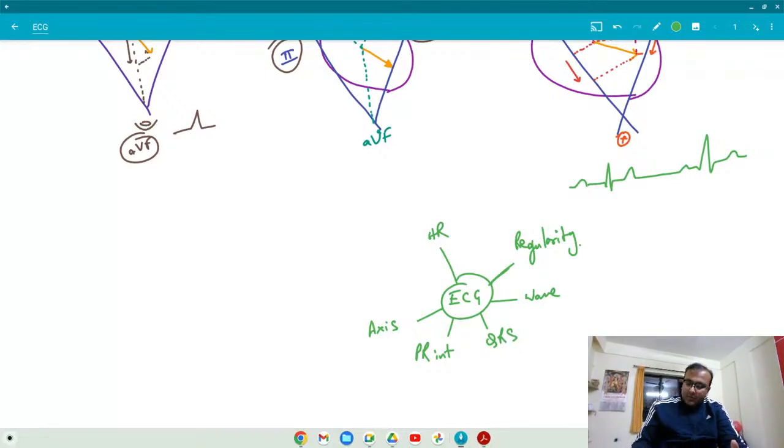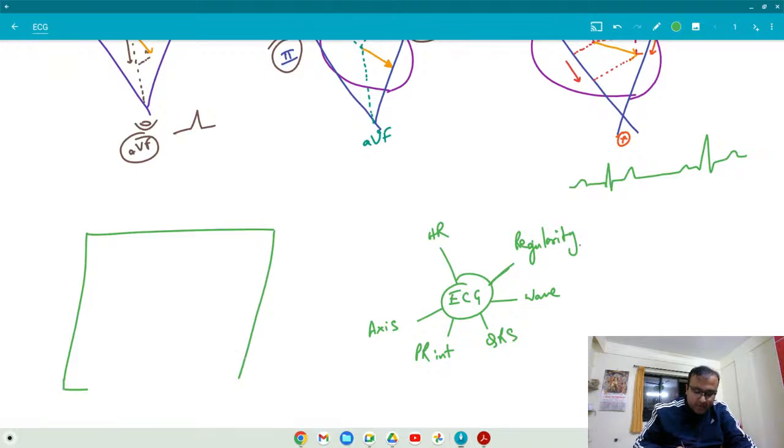So we can check how many? One, two, three, four, five, six. These are six things that we can actually check about it. And you understand each of them, they're pretty important in diagnosis. So it's very, very simple. It's not that difficult. So in practical reality, next time you get an ECG paper, I'll tell you how to deal with it. So suppose there is an ECG paper, right? I'll tell you the calibration, your job becomes very easy.